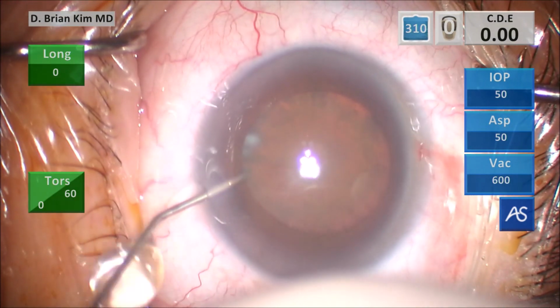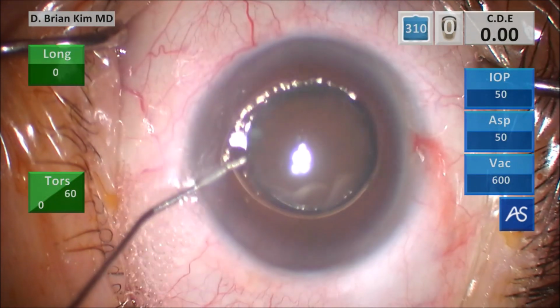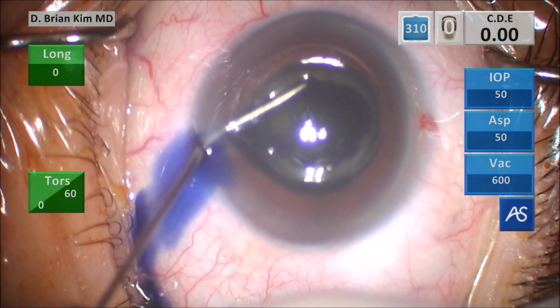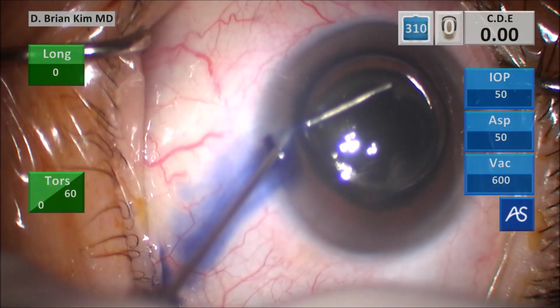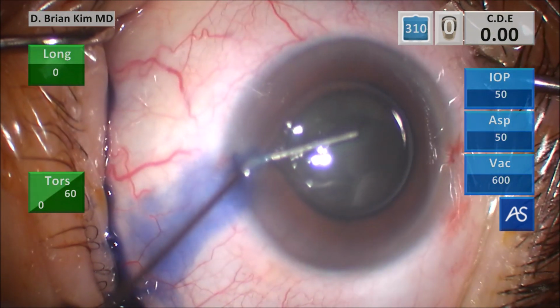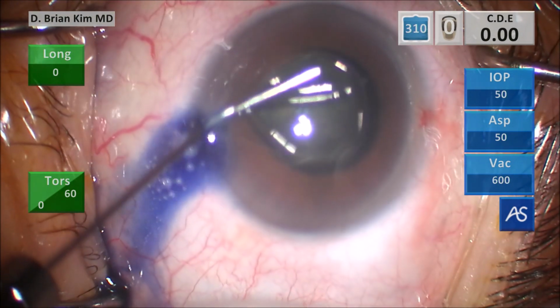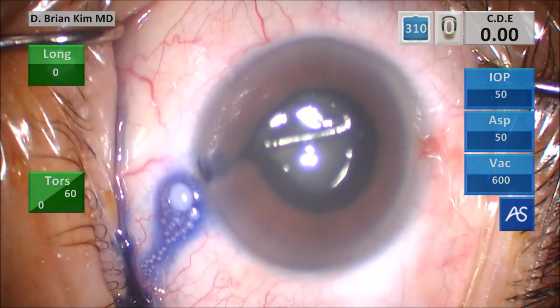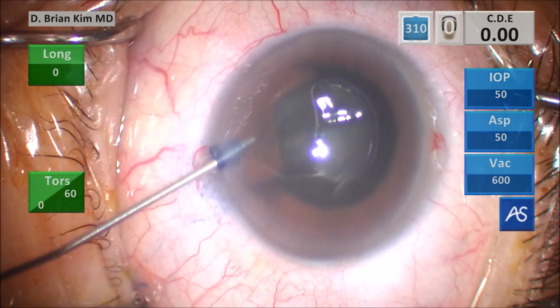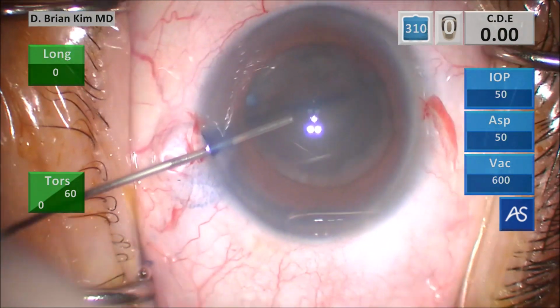This is intracameral epinephrine, and then some intracameral air because this is a rather dense lens. And then this is some trypan blue, and I like to paint the anterior capsule surface with the trypan blue. I don't like to indiscriminately push too much dye and have it end up in the vitreous space. I don't know what that dye can do to the patient, and I certainly don't want to expose this dye to the patient's retina. So I'm going to very gently, using a paint roller technique, roll the dye on the anterior capsule. And then I'm injecting the anterior chamber with dispersive viscoelastic and pushing the dye and the bubble out.